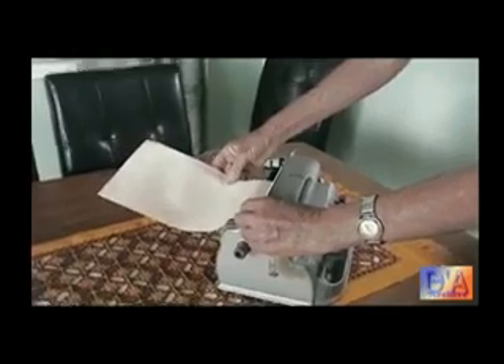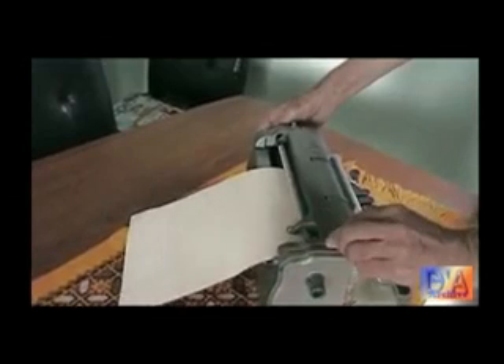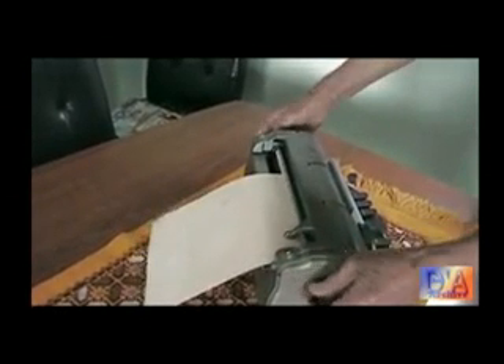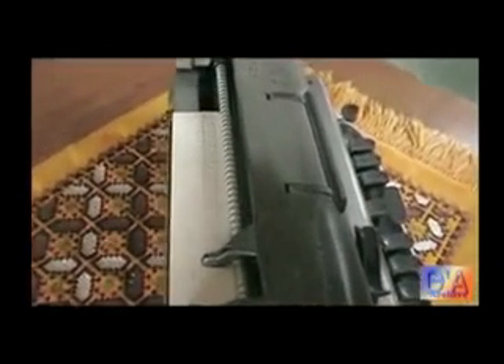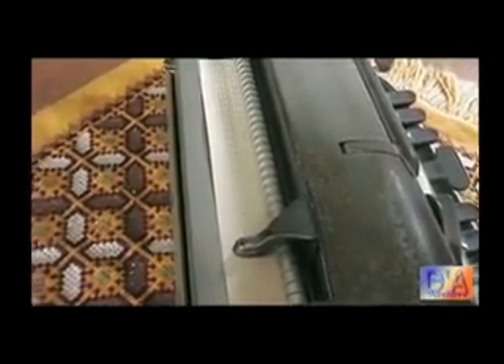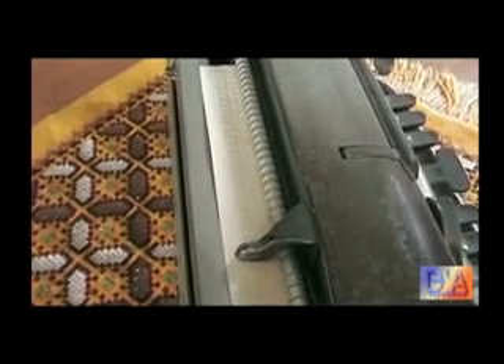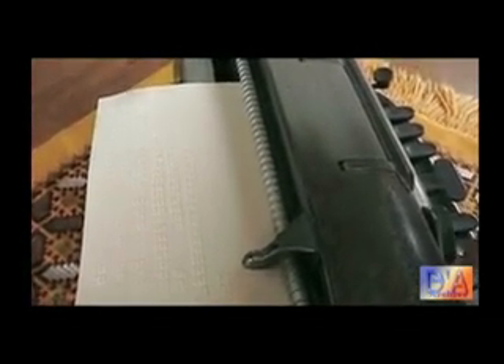You can put the paper in. Yes, I'll put the paper in. The paper keeps rolling in and when it's in the right position it automatically stops. So there you can see the two rows of Braille at the moment. And we'll just wind that out to a fresh piece of paper.